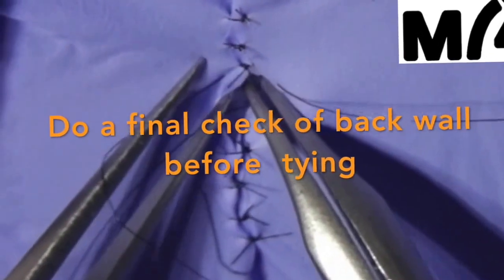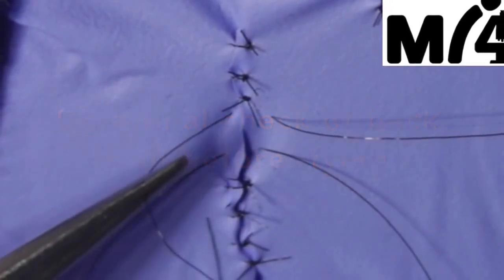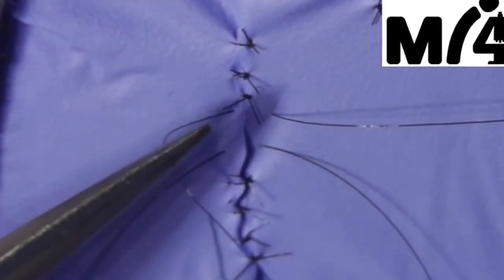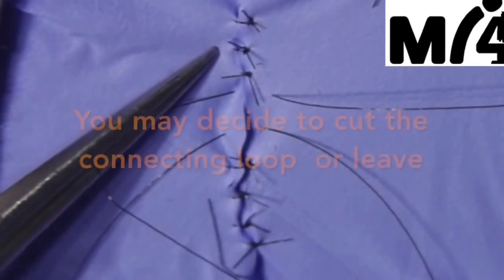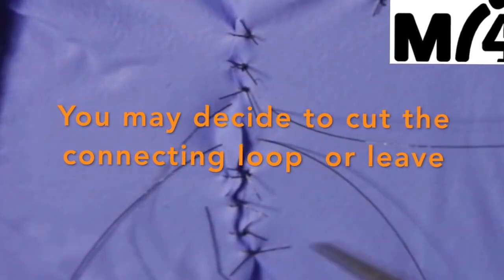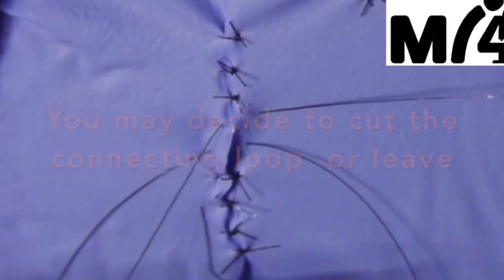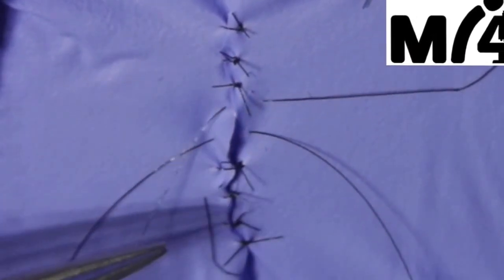Obviously this is an anastomosis, but I've got enough space to see that everything is safe. Now lots of CT surgeons do different things. This loop connecting the two passes — you can cut it here and tie it up as separate sutures. I just like to keep them connected.